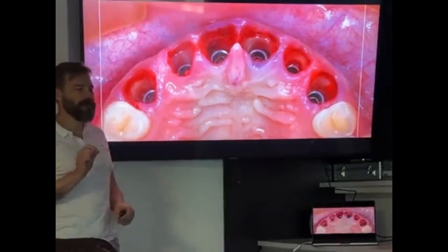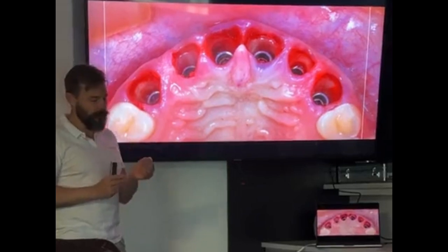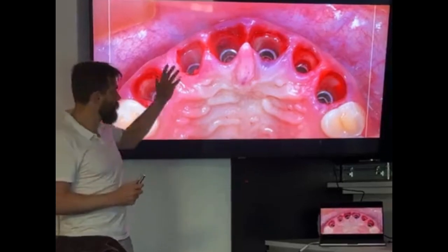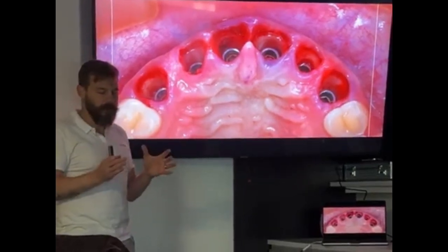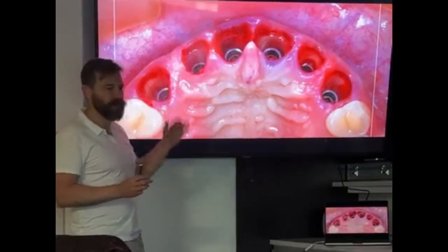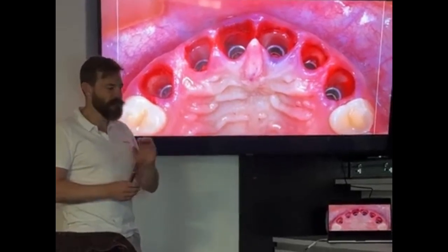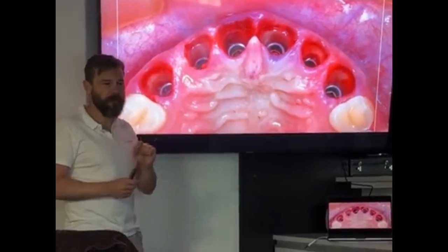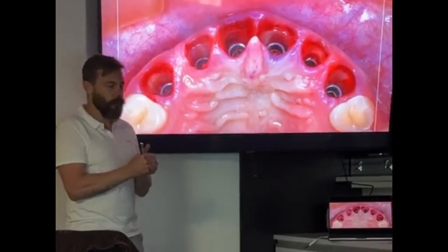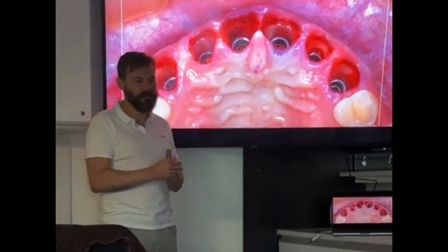One key point that you need to ask yourself when you are dealing with the socket is whether the material you are putting inside that structure, inside this socket, is mechanically stable, or if you move something on the buccal side, you see some movement of the material. That is the key point, right? To decide if you have done a good job or not, or if you need extra protection or extra mechanical stability. Once the material here is completely stable, then you have done your job, right?